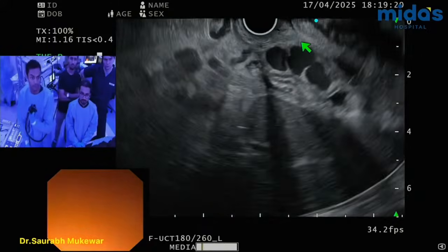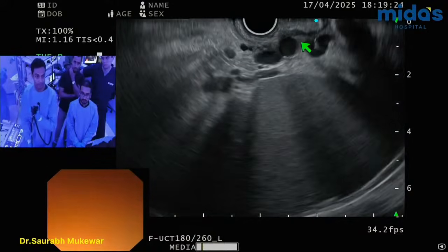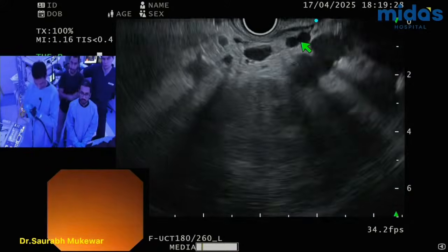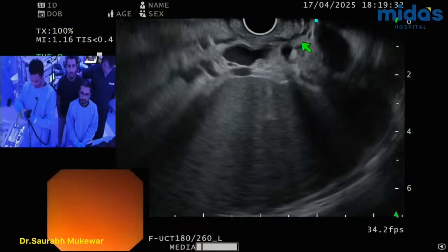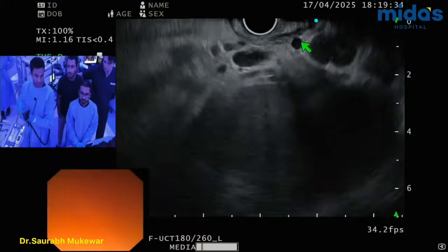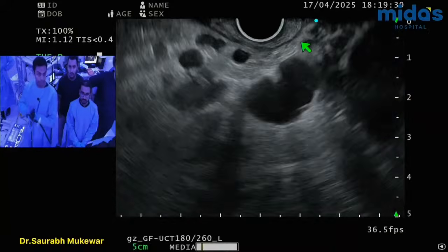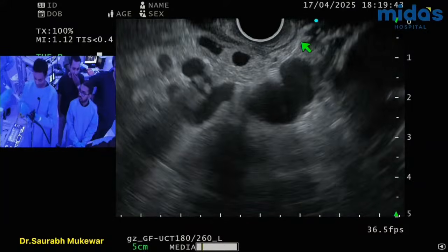So I want to get a position which is stable. Yeah, I think this is where we want to go. That's what I've started doing now. I put in an effort to find the feeder and go for it. I do it right at the penetration.